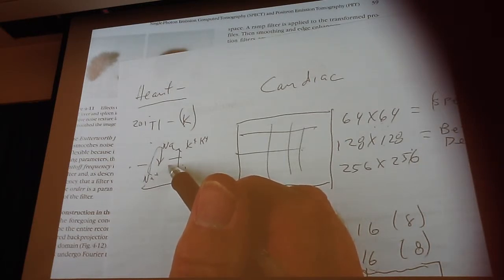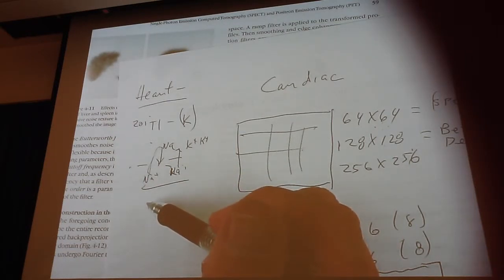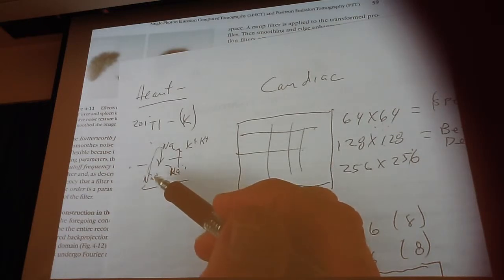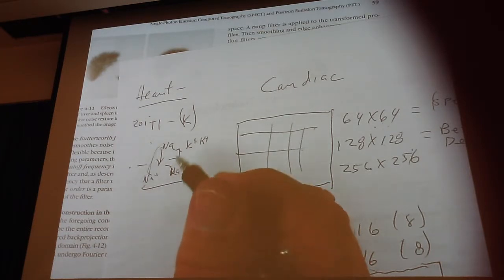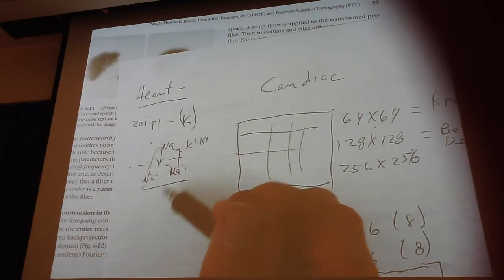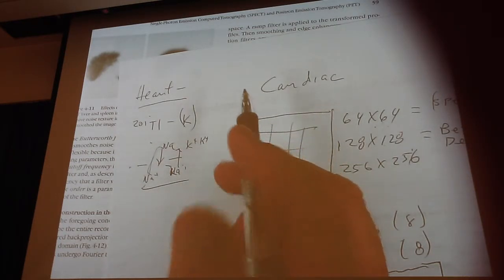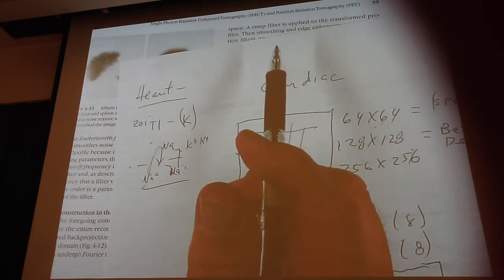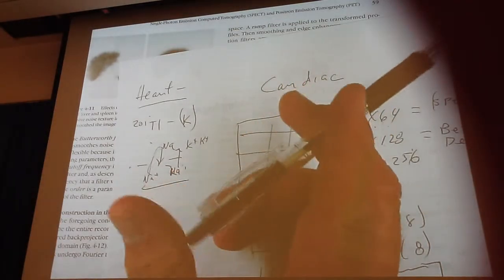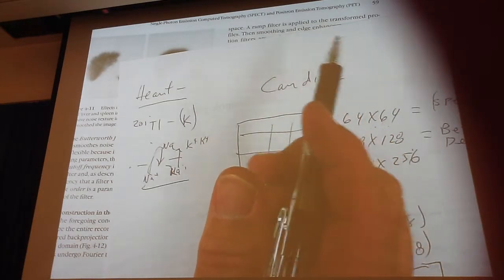Does that make sense? So either you're creating an artifact that doesn't exist, so in other words, now your patient has either myocardial ischemia or an infarct that isn't there, versus maybe you may be masking a defect. So the guy does have an infarct or does have ischemia, but because the protocol is being applied in the wrong sequence, now the guy says, hey, you know, Radke, you're perfectly normal. Oh, really? What about this horrible chest pain that I'm having? Oh, it must not be your heart. It's probably something else. You probably got indigestion. Oh, okay. Walk out the door and boom, heart attack and I'm dead.